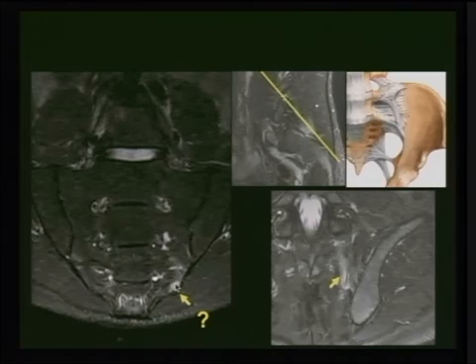It is the attachment of the tendon or ligament. So this is enthesitis. If you know the normal anatomy of the pelvic region or sacroiliac joint, you see that this is the site of attachment of the sacrospinous ligament. This site is the sacrotuberous ligament. So this is an important issue: if you know anatomy, you can explain some of these changes. So this is a case of enthesitis.